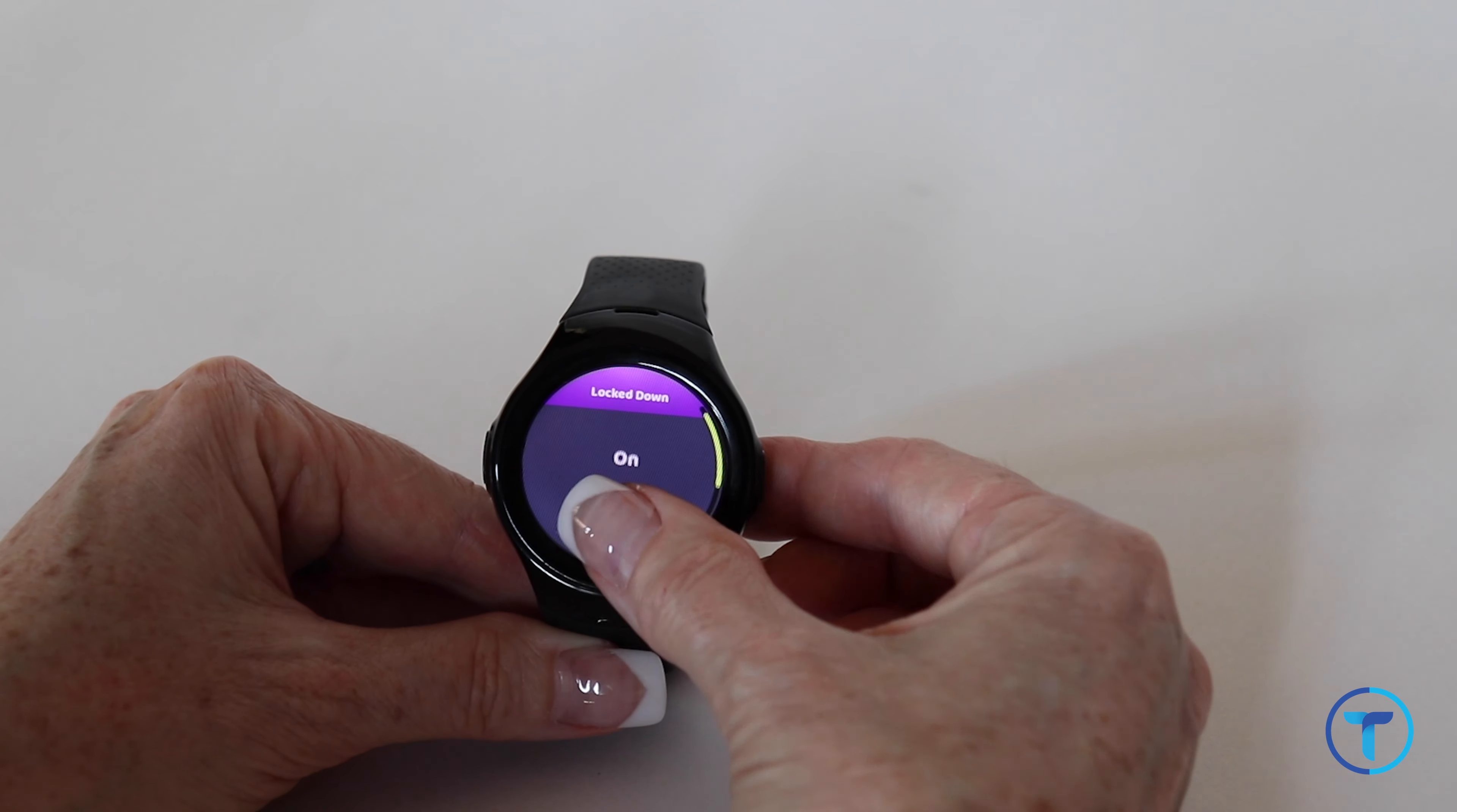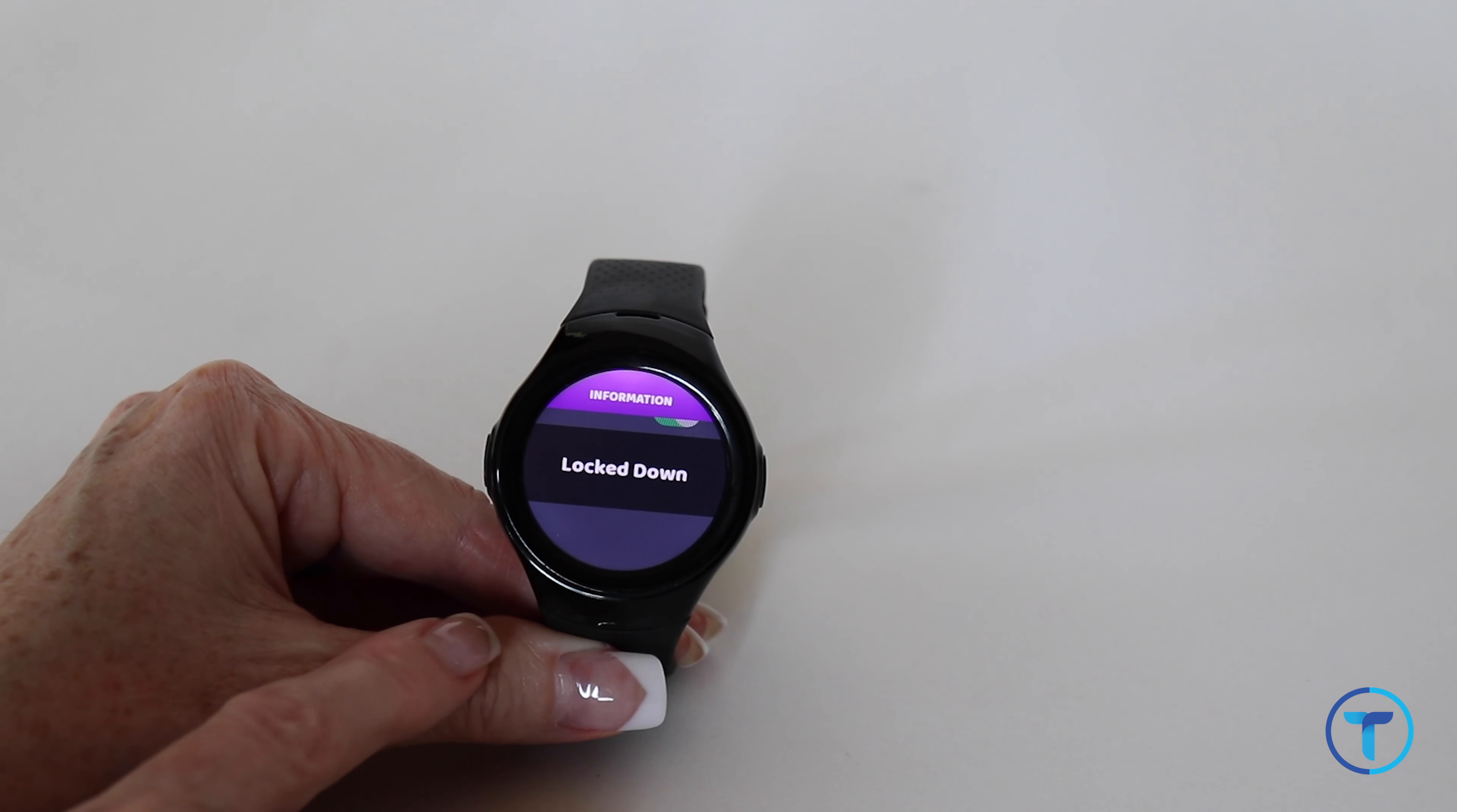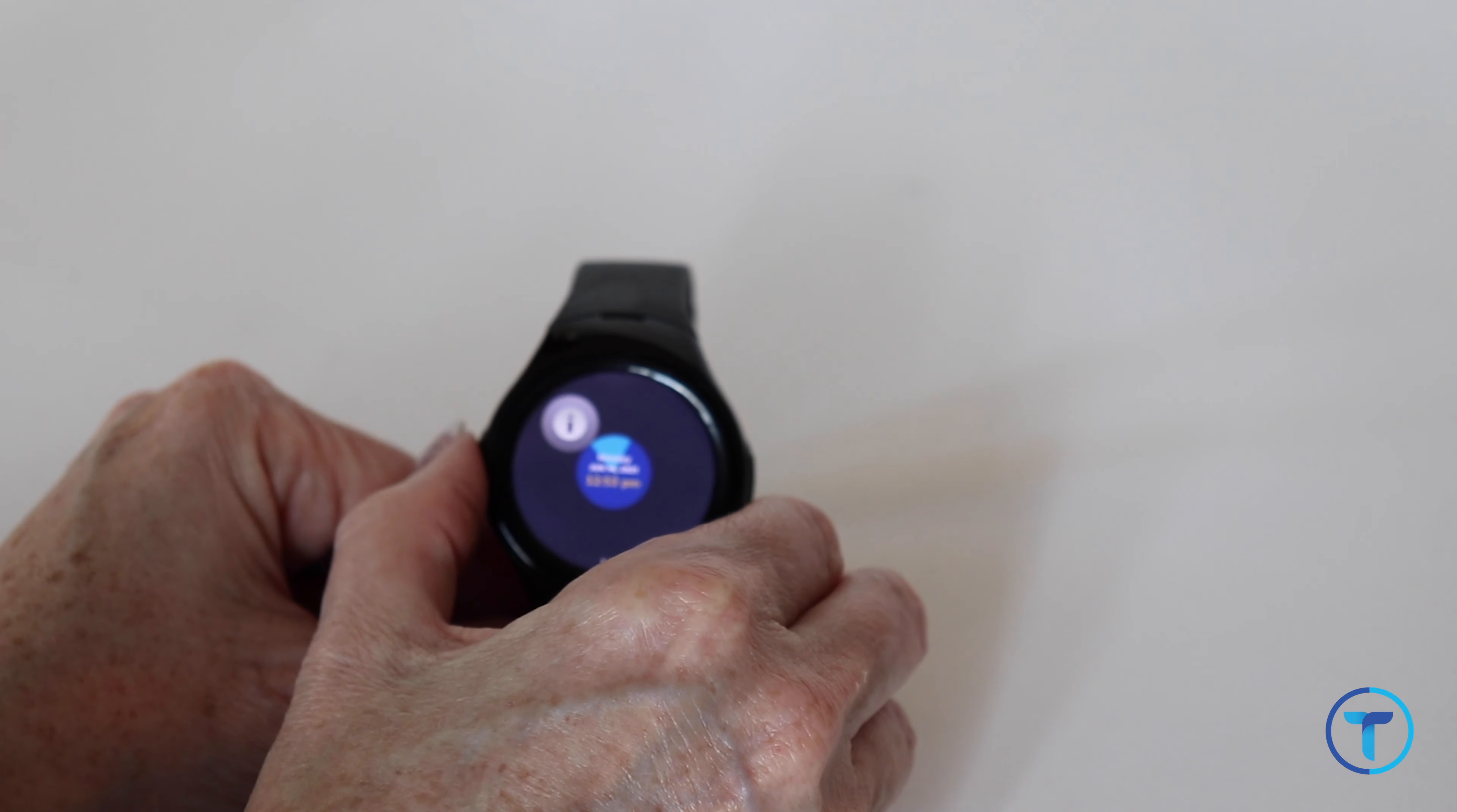Swipe from the top of the screen to the bottom and press on. Now it's locked down. To get back to home, quick press the SOS button located on the left side of the watch face until you get back to the apps screen.